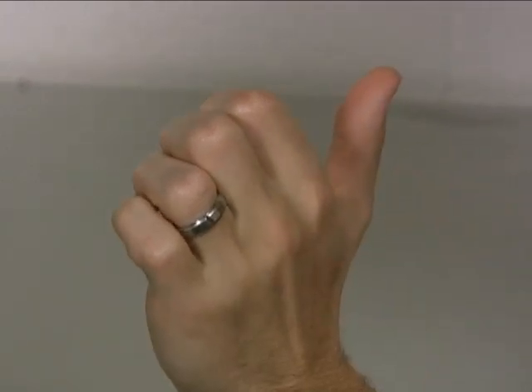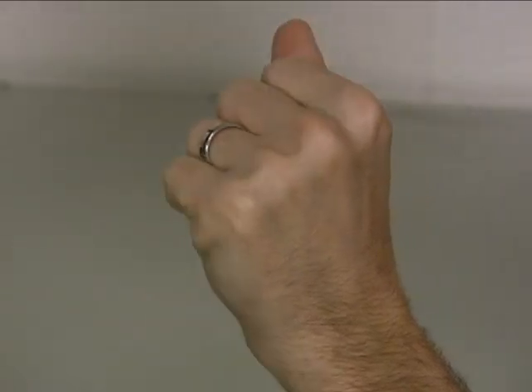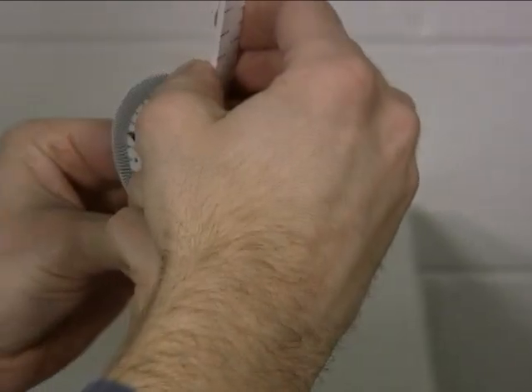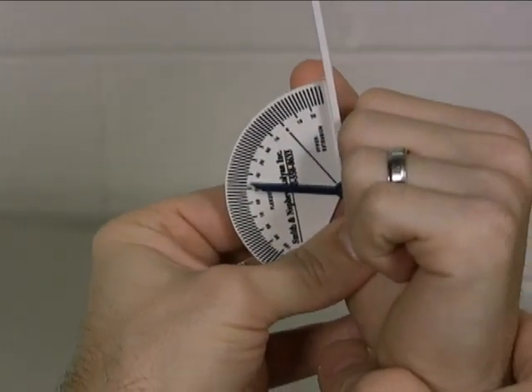According to the American Society of Hand Therapists, however, it would be measured in a full fist. And that's a little difficult to do because you have to kind of scooch your goniometer in there to measure that.